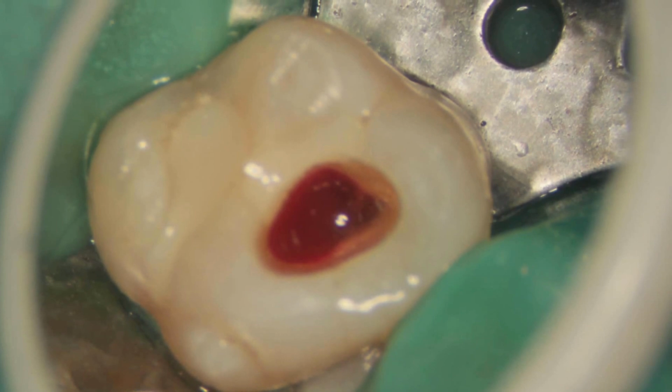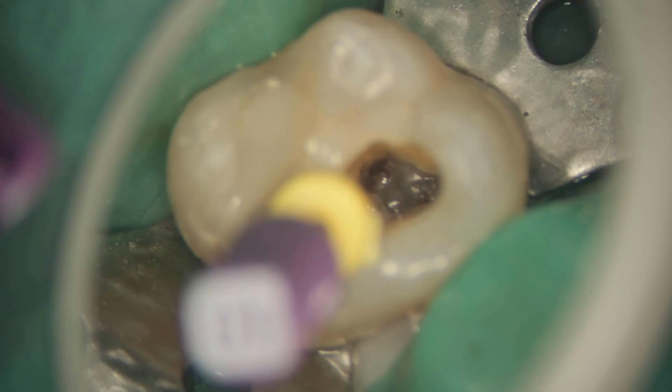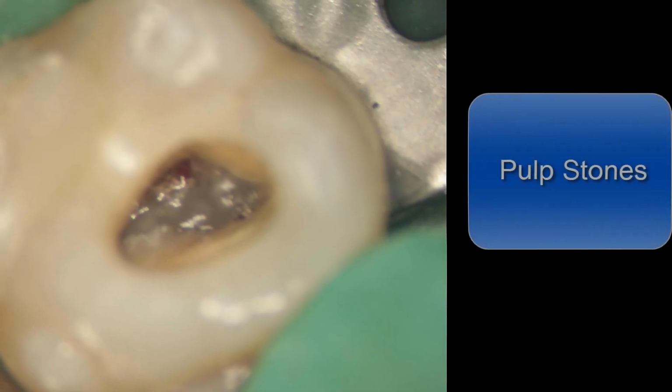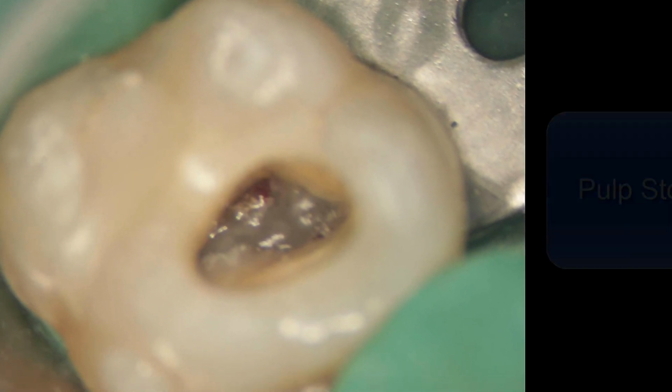Now, this is the initial access with penetration of the mesiobuccal pulp horn. This is clearing the pulp space and passing a file through the DB canal system to see if it's patent through the resorption area. You will notice that there is a thick attached pulp stone to the pulp chamber floor.